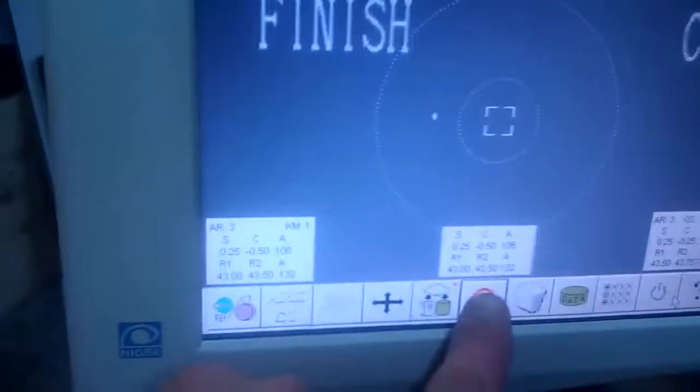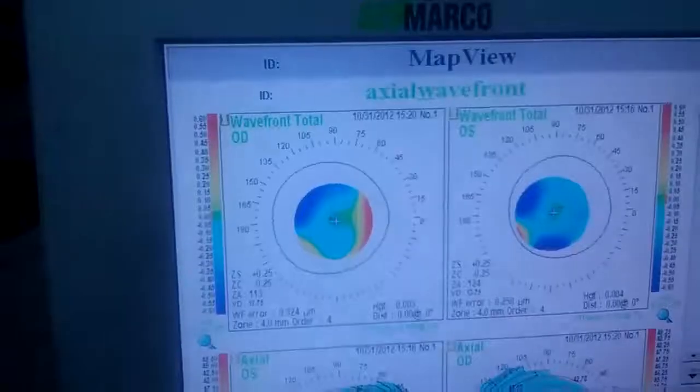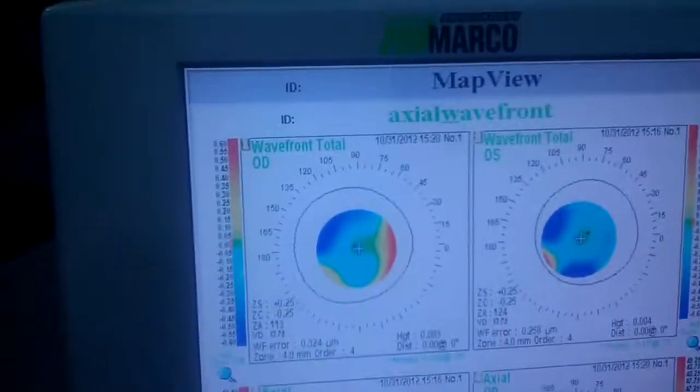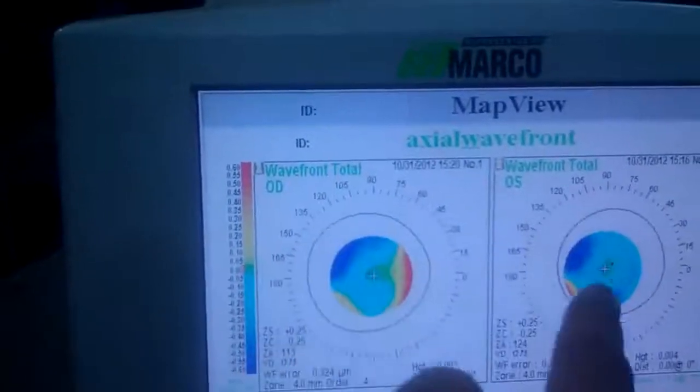We'll go to the map page and pull that up, and we'll look at both eyes together here. And here you can see the wavefront total, right and left.